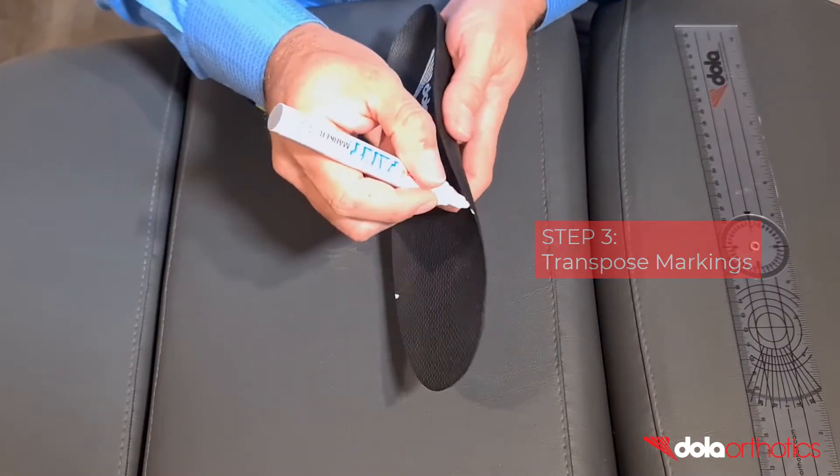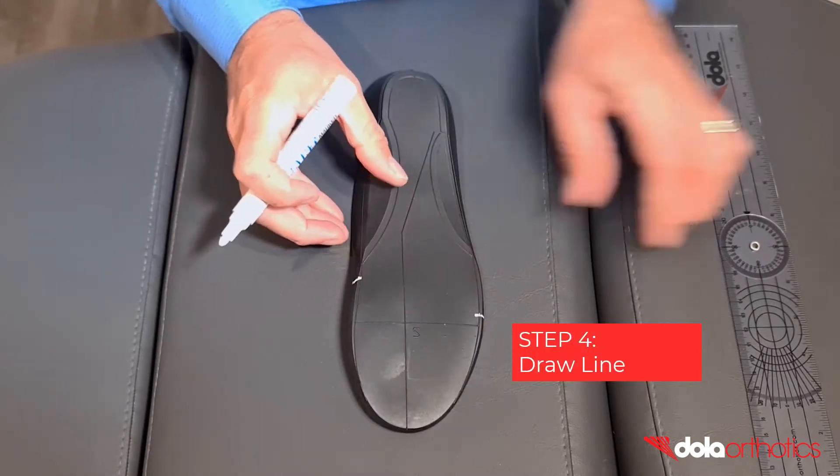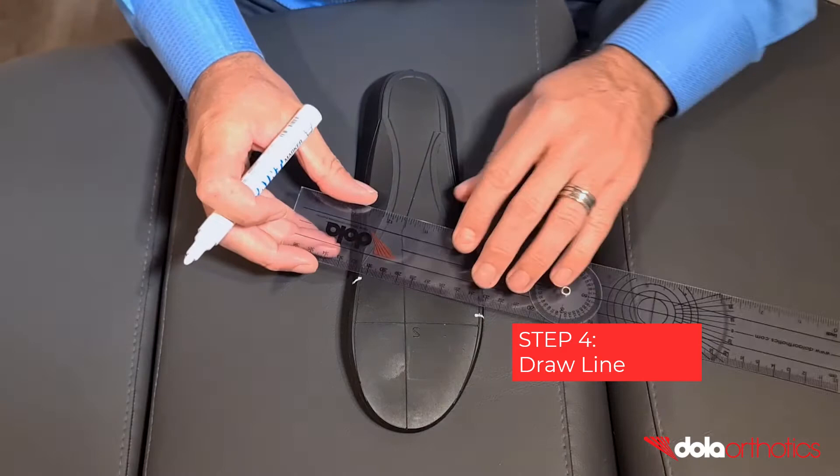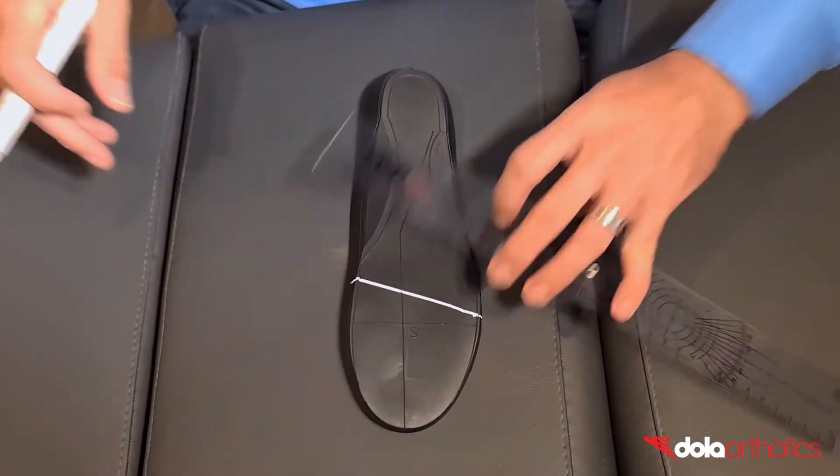Step 3: Transpose the medial and lateral markings onto the planar surface of the orthotic. Step 4: Connect the two points with a line to indicate the angle of the gait plate. You now have your in-toeing gait plate marked as a guide.